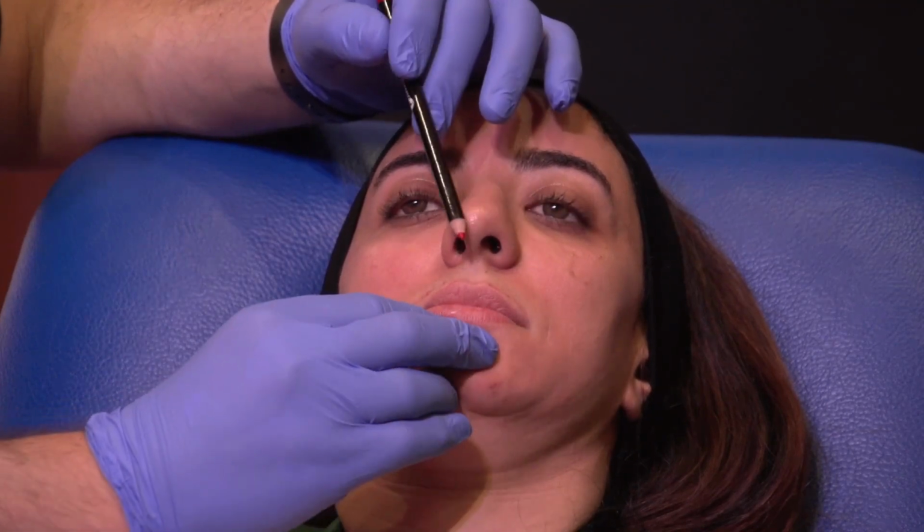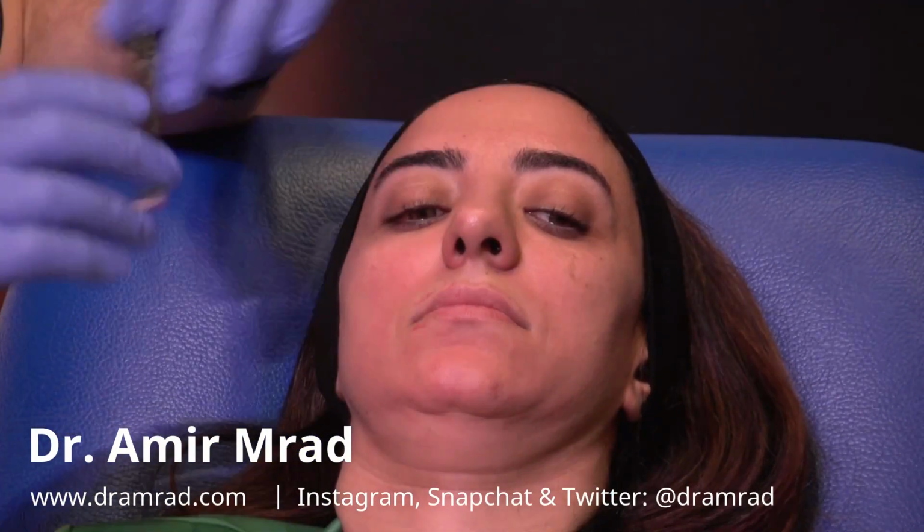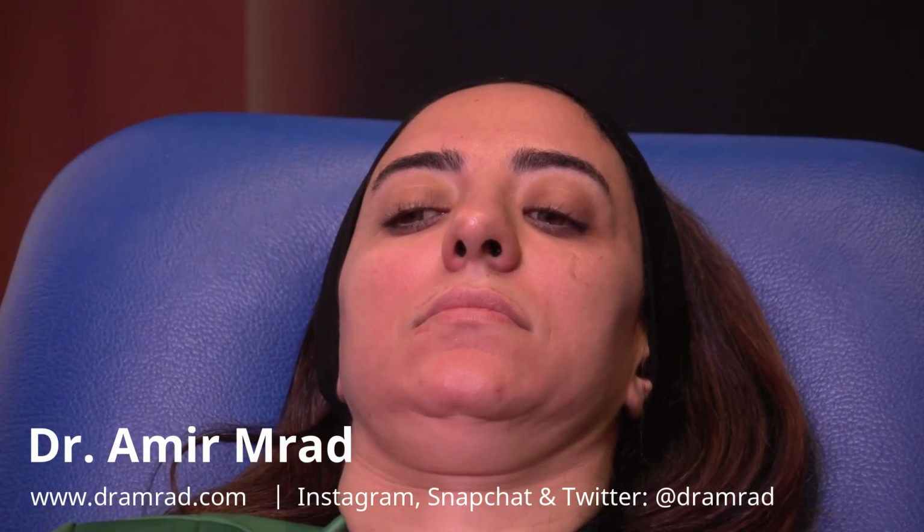You'll have a fuller lip in the middle and narrower on the side. That's lip pinching. But what we'll do today, for the sake of time and patient satisfaction, is we'll just augment the lip in total.